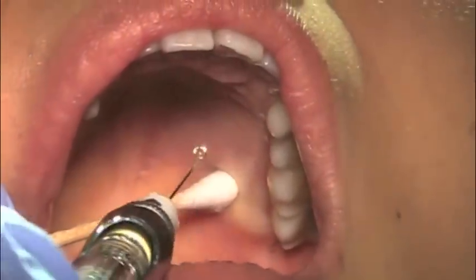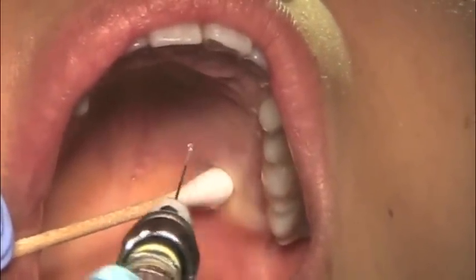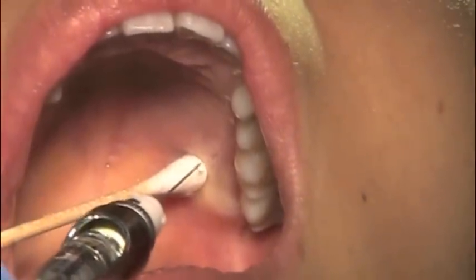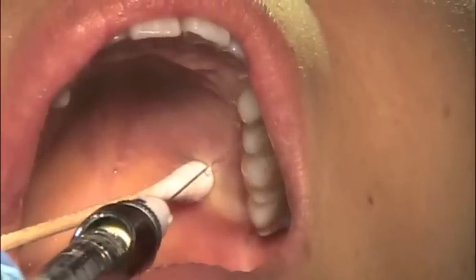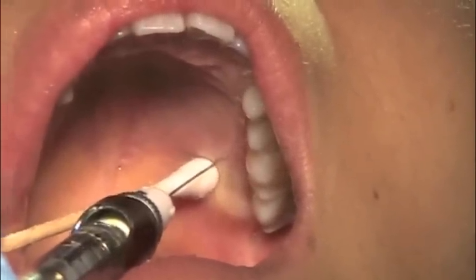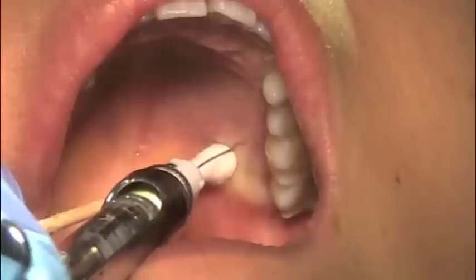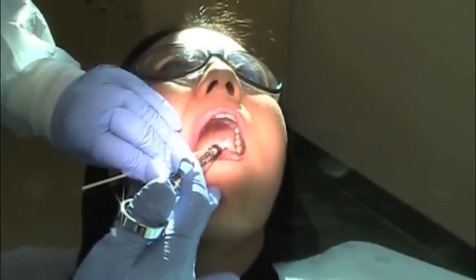Roll the cotton swab, then insert the needle at the pressure site. Advance the needle until osseous contact, then aspirate once. Stabilize the syringe well.